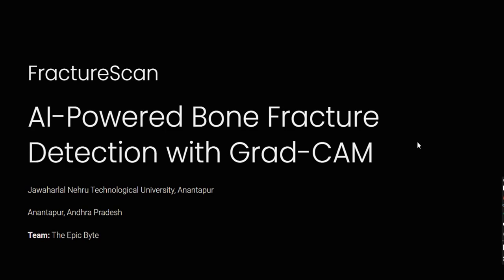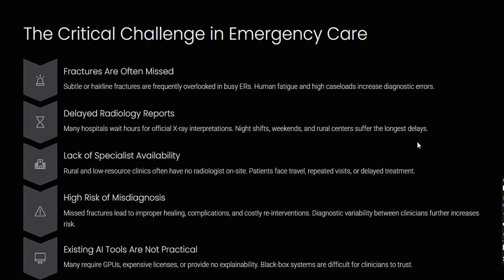Now, let us deep dive into the problem statement. Basically, in emergency and rural healthcare settings, bone fractures are often missed or diagnosed late due to heavy patient load, human fatigue, and limited availability of radiologists. Subtle fractures are often difficult to identify, and radiology reports frequently take hours, especially in low resource hospitals. These delays increase the risk of misdiagnosis and improper treatment.